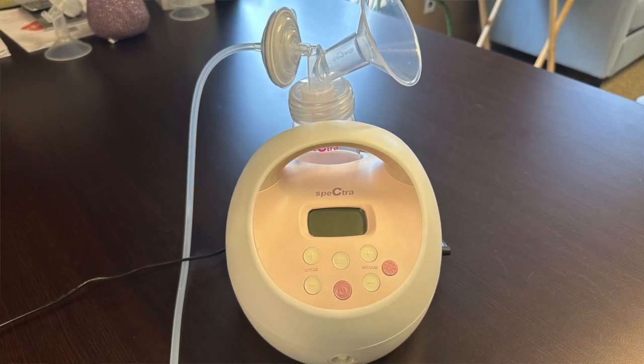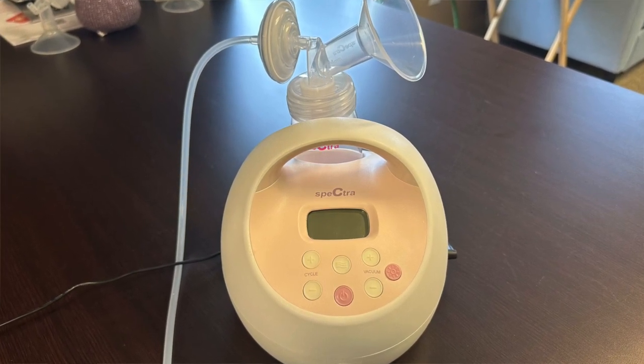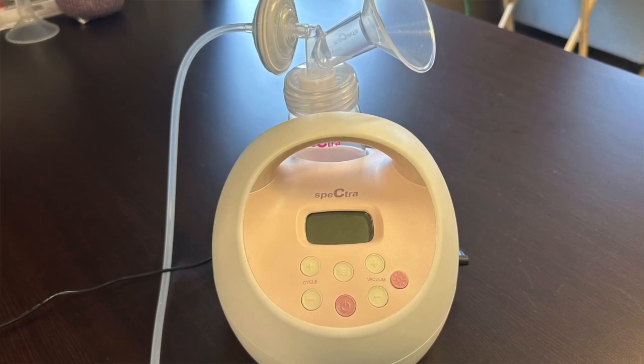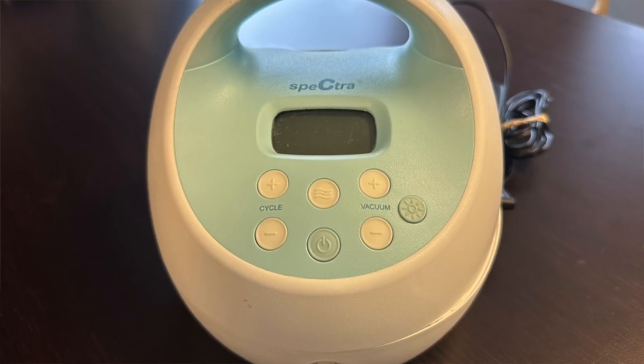Today we're going to teach you how to use your Spectra S1 or S2 pump. The only difference between these two pumps is that the S1 can run on a battery which has a three-hour battery life.